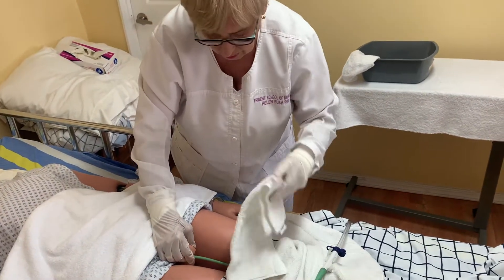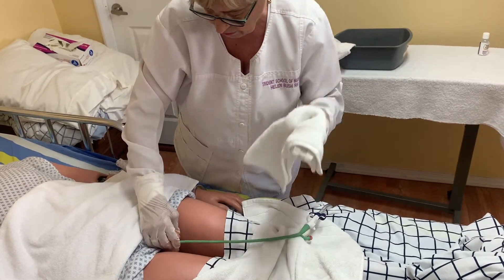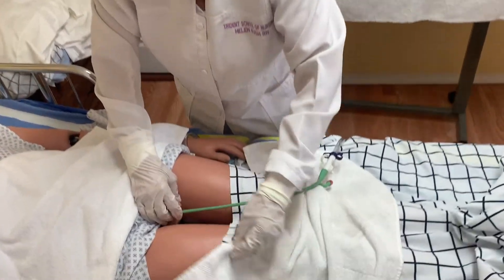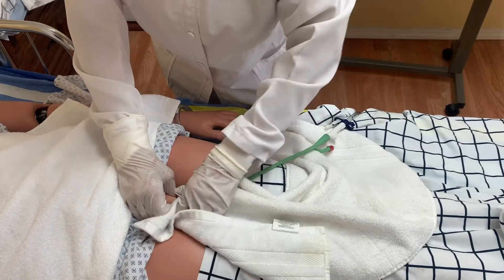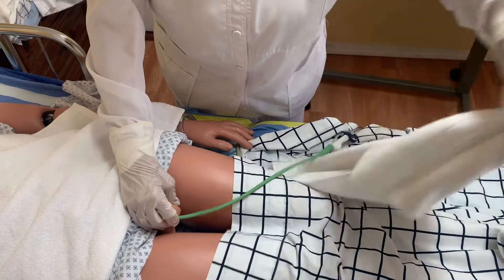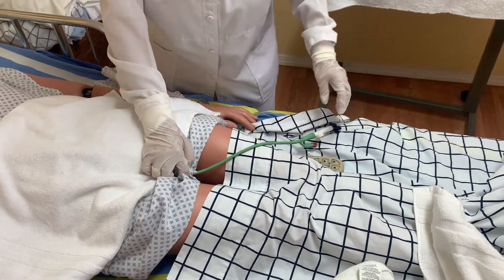Do the second and third stroke — like when you do female perineal care. After that, you can pat it dry. The same direction from in to out. You can use the other side of the towel. We are finished cleaning the Foley catheter.